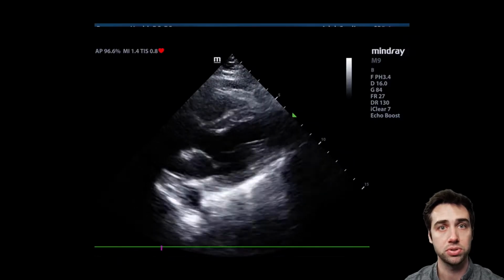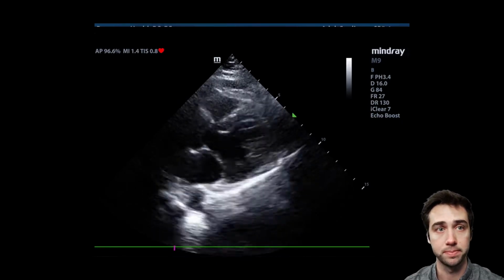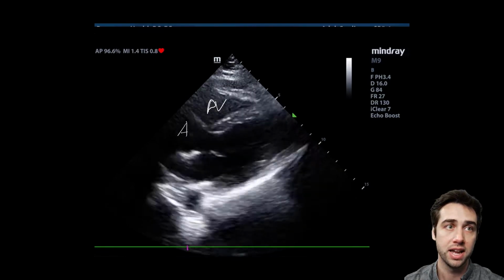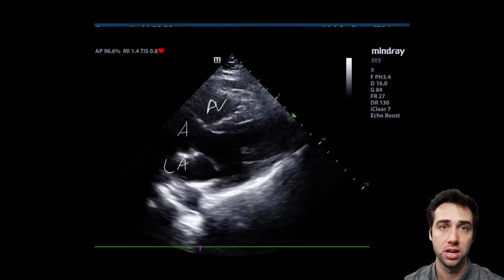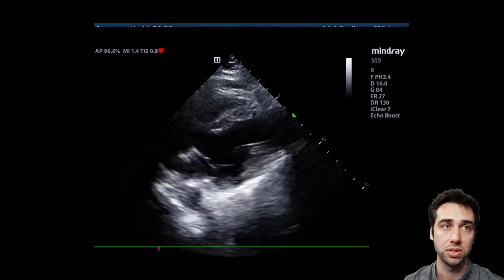Let's look at the ultrasound just by itself. Make sure you can identify all those structures again, and we'll talk about a couple things you should always notice in here. First thing, you should see the right ventricle, the aortic outflow tract, and the left atrium should all be about 1 to 1 to 1. If you notice that any of those structures are much larger than their corresponding structures, that would indicate to you that there's some sort of pathology going on there.